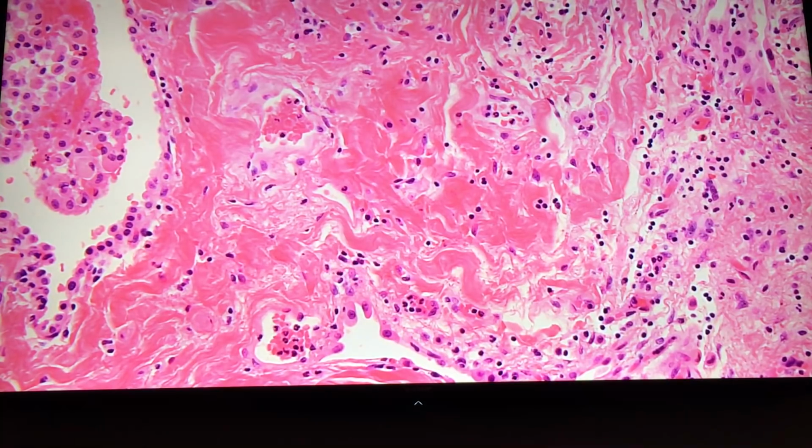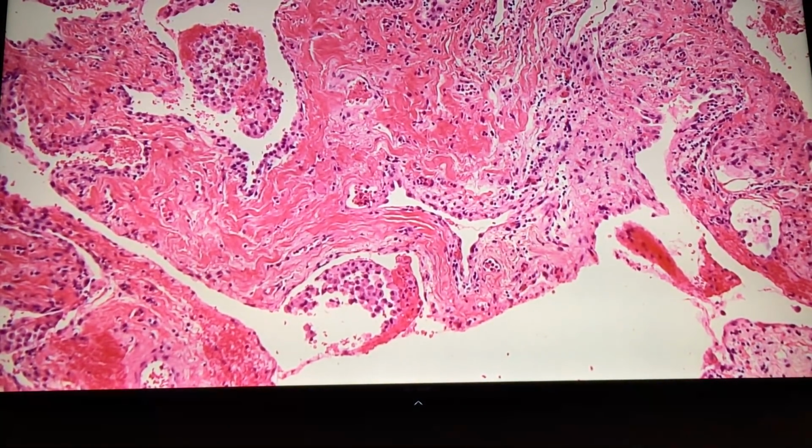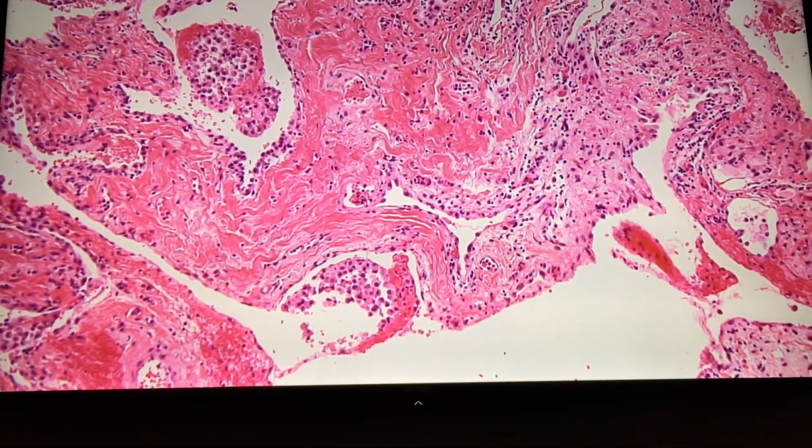Go one lower mag. It's collagen, a lot of collagen in there. That's not normal, right? Yeah, no. So, any thoughts about what's going on there? Is it just non-specific? Ignore this and look at the cancer. There's no cancer here. Okay, go back low mag, Aaron.